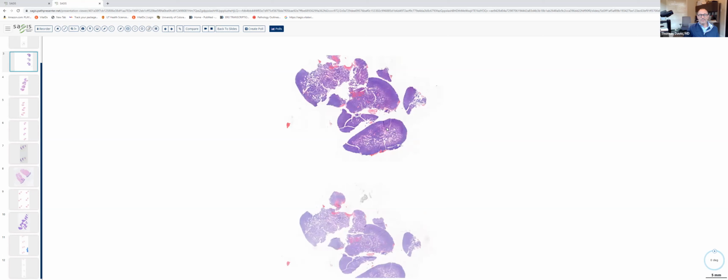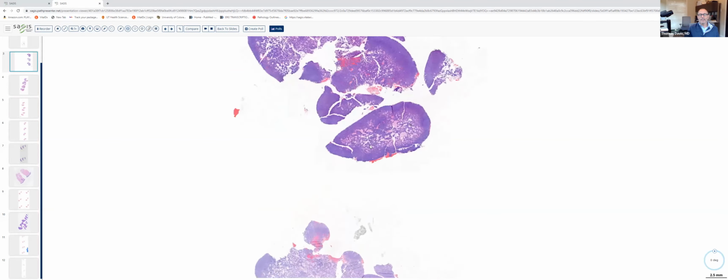And at scan, one can see that we've got kind of a blue tumor or blue ball present here. And the blue staining is generally due to hematoxylin staining the nucleus. So we've got a lot of nuclei here that we'll want to take a look at. Overall, even though this is fragmented, the fact that it's fairly well circumscribed would indicate that it's got more of a benign silhouette.